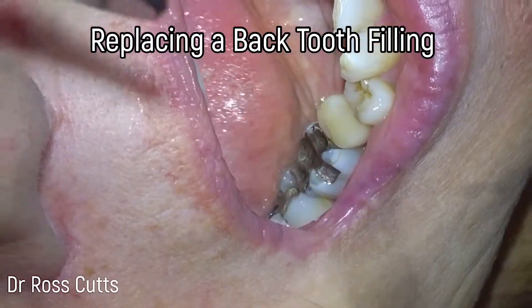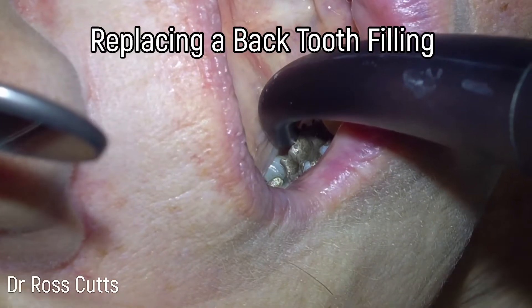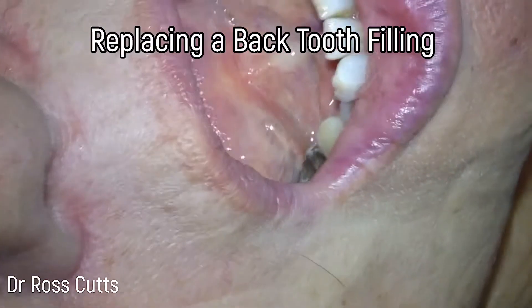Hi, my name is Dr. Ross Cutts and this is my video of replacing an old silver filling with a nice new tooth-coloured restoration on a badly broken down back tooth.